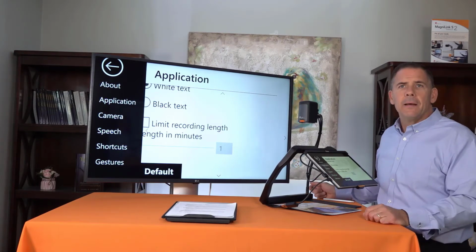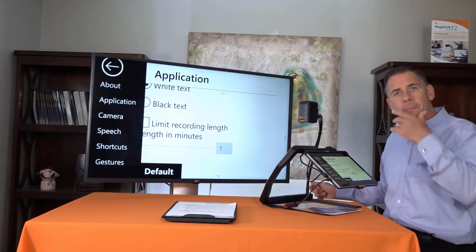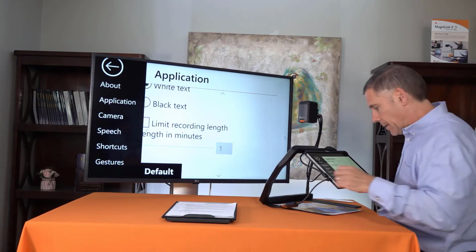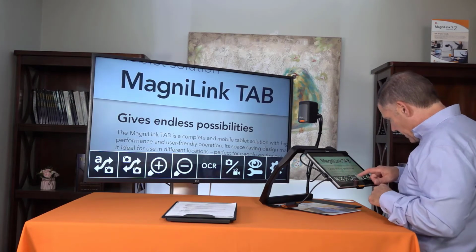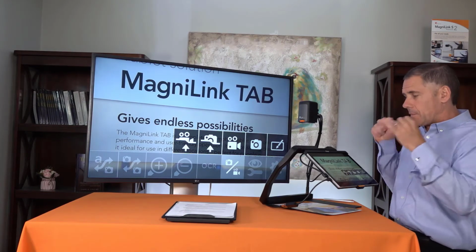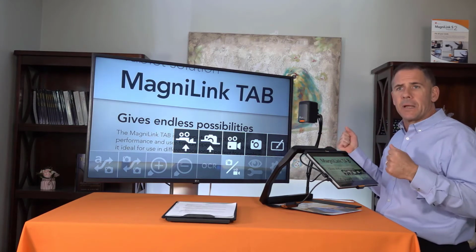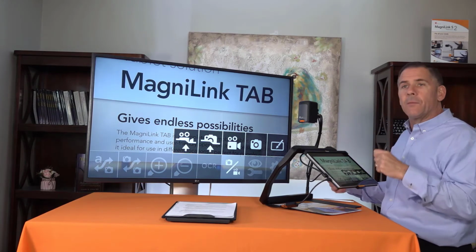I love that. You know, this thing will work just fine if you turn on narrator. Everywhere I go, it'll read it to me. You can turn on the voice within our software too. But narrator, you know, double tap each button, it activates it and all that. We're not going there. All right, so down here, you can now open and save documents from within. I can open and save. That's what the first two are. And then, of course, I can go into my video or my picture taking. But that's really cool now that I can just save it within here or open it within here.